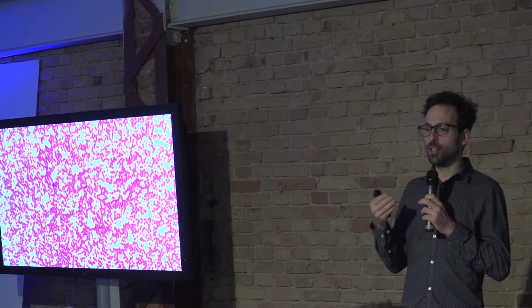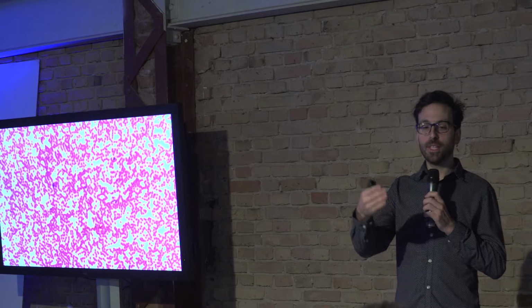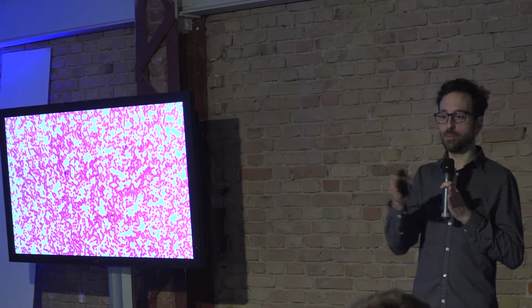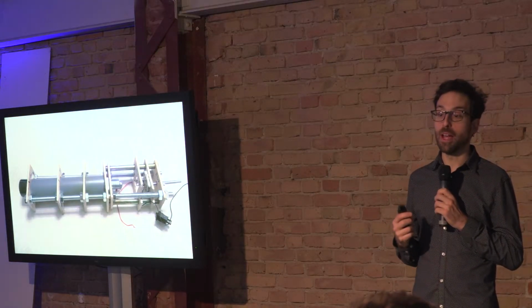So what I did was, I'm a maker myself, I'm an engineer, so I disassembled it and changed the sensor. It mounted a 0.3 megapixel sensor, so I put in an 8 megapixel sensor, and I moved it a bit backwards. The idea is that the farther away you are from the objective, the more the light is going to open and the more you're going to magnify. But as I'm not an optician, I realized that's a good idea on paper, but what gives you the resolution is the objective, and this microscope has a really bad objective. So I had to go to creating my own microscope from scratch.